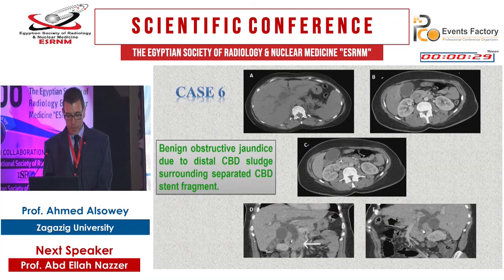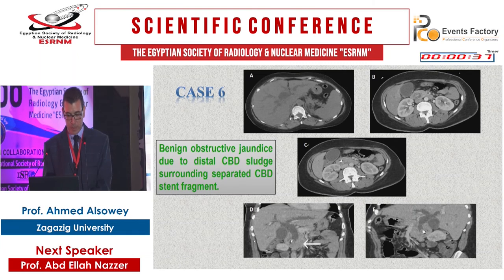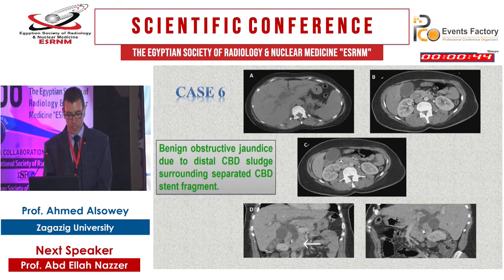A final case involves common hepatic duct and common bile duct stent removal two months ago, and there is a retained common bile duct stent fragment. This is a dense fragment surrounded by biliary sludge, with retrograde dilatation of the common bile duct and intrahepatic biliary ducts.